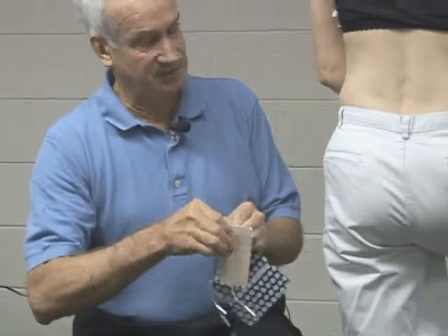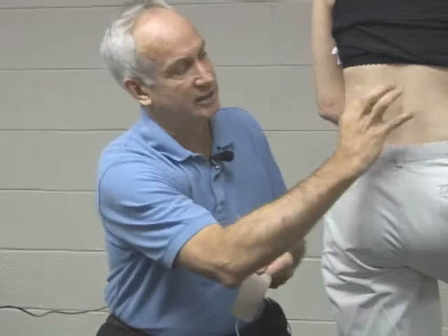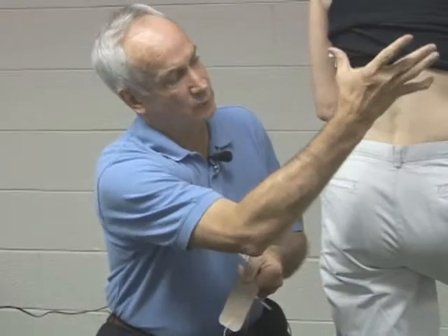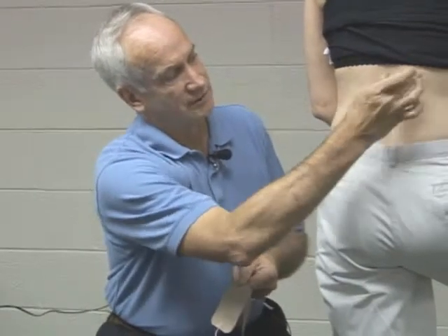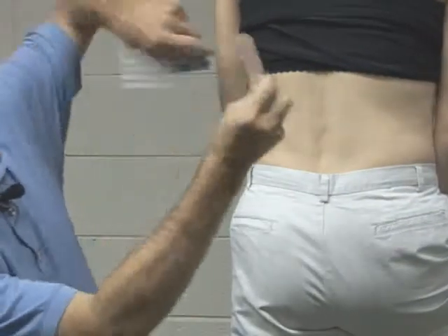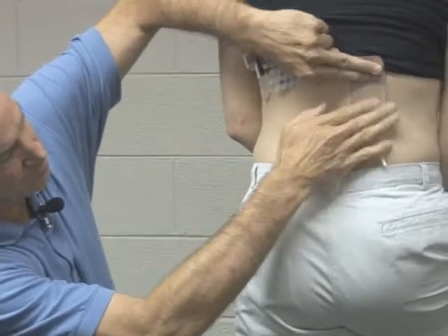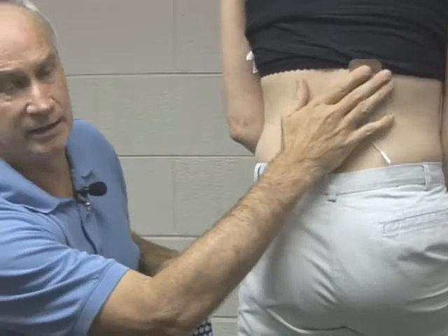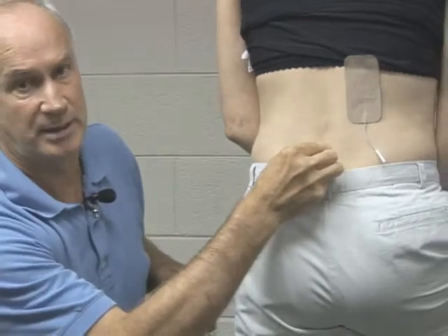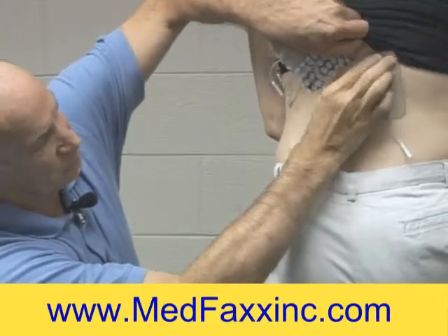I would ask Elizabeth where her back is hurting. She'd say it's all through this area — a little tender here, a little tender here, maybe a little tender here. I want to go to the outside corner where the pain is coming from. I'm going to put the electrode away from the spine. We don't want electrodes near the spine because there's no muscle there, so there's nowhere for the electricity to go. So I would put this electrode on.